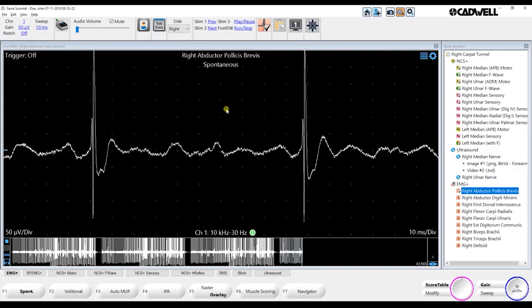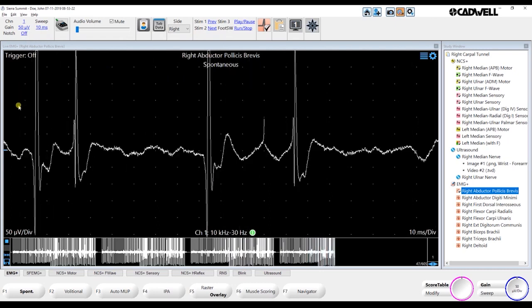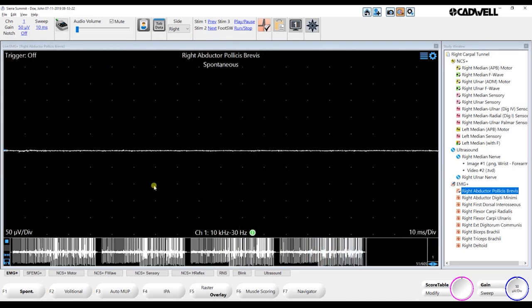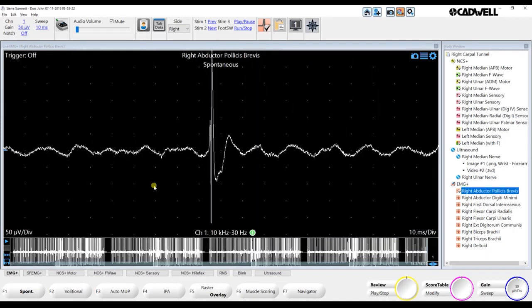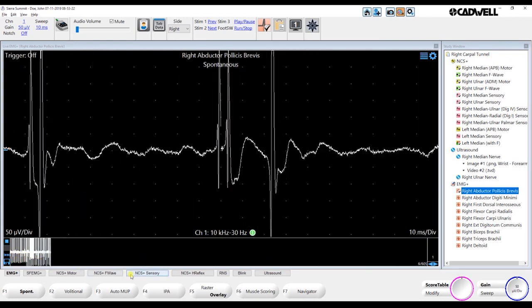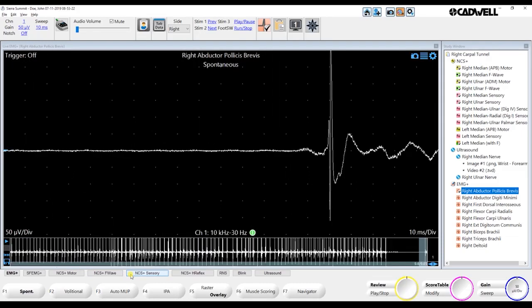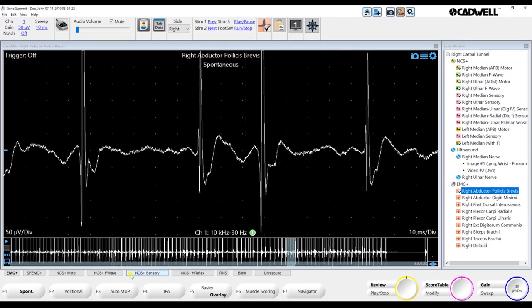Second, we want to make sure that the image is clear and consistent. So you have full control over the background grid, over how the image is displayed. When we hit stop, you can pause, and you'll notice down here at the bottom this is a buffer. So I'm going to run again, and you'll see that this is our buffer, what we've been running so far. I have it currently set to a 60-second buffer. You can make that longer or shorter, but anytime you can just stop, and then with the yellow knob I can review back through what I've recorded.